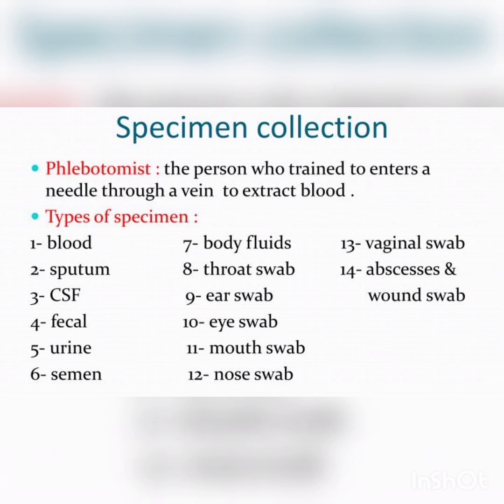Some points to be remembered while collecting the material for microbial examination. If you are collecting a specimen for microbiological study, you need to keep some points in your mind. They are: number one, you need to collect the specimen before starting antibiotics or antimicrobial agents.